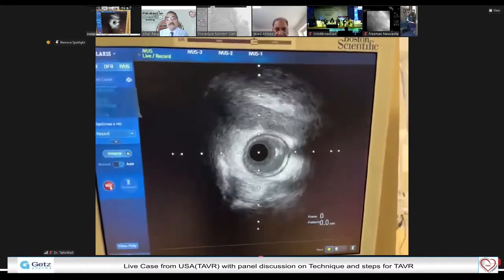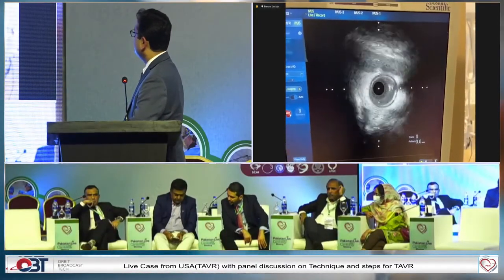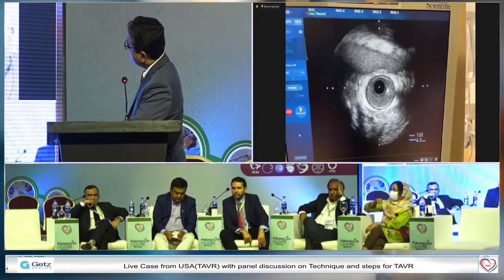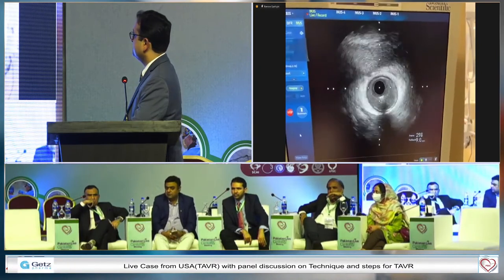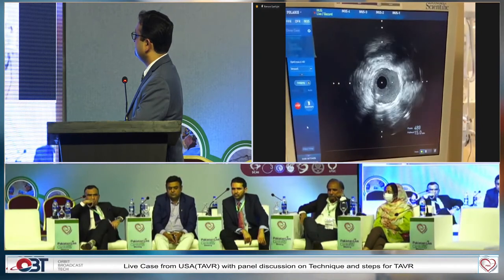So the IVUS, obviously, you saw is embedded, so we can see it on our monitor. We've now stepped outside, so we can look at it a little more carefully. Sorry, Dr. Tahir Kelly, can you hear us? I think it's stuck there. You can just do a manual pullback. Oh, there it starts, right there.